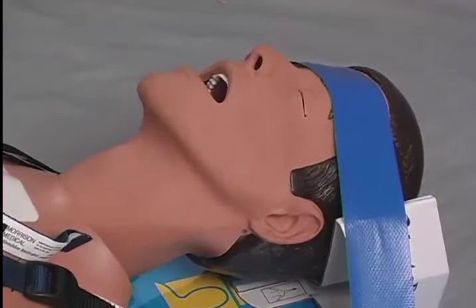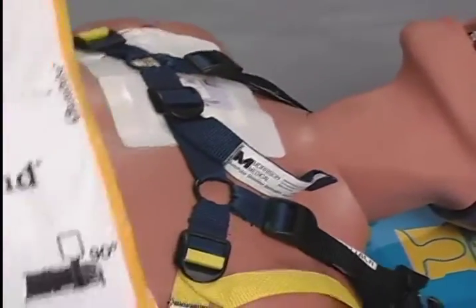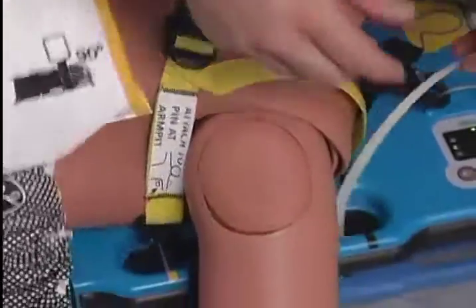When using a standard backboard, the patient needs to be properly secured to the autopulse, preferably with the shoulder restraint and head immobilizer. Once the patient has been secured to the autopulse, secure the autopulse to the backboard with zip ties.